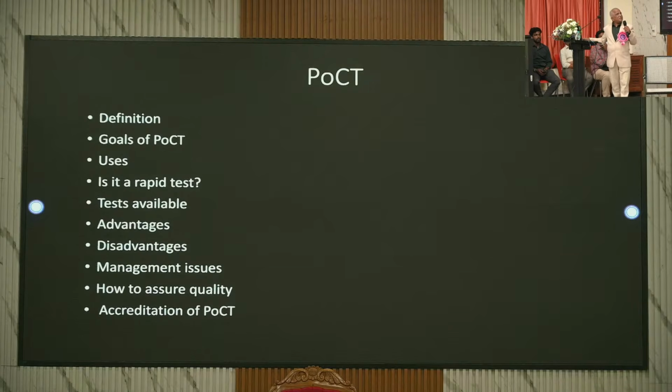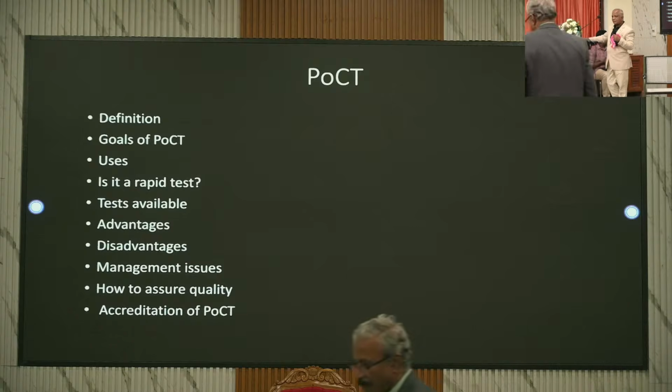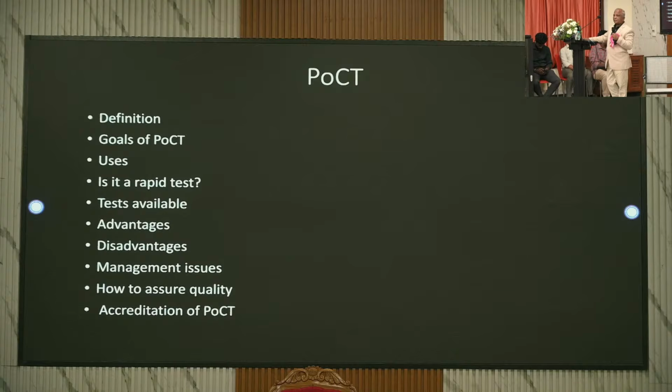So what are the things we are going to cover within these 10 minutes? Definition, goals, uses, what is a rapid test? When will you say a test is a rapid one? 1 minute, 2 minutes, 5 minutes? Is an HIV test a rapid test or not? Immunochromatographic test. Is a pregnancy test a rapid test or not? Is there any time limit? Any test which can be interpreted within 5 to 30 minutes is called a rapid test.